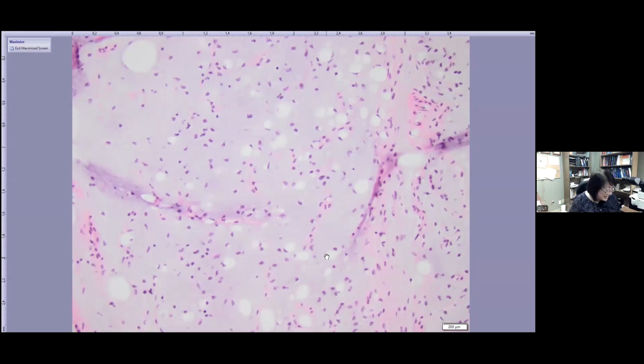Anyone want to give a try? Myxoid liposarcoma, because the patient age is older. And we went ahead and did a DDIT3 break apart. It was positive. Immunostains usually do not help. The diagnosis, let's see, myxoid liposarcoma, the majority is well differentiated, low grade, like this one.